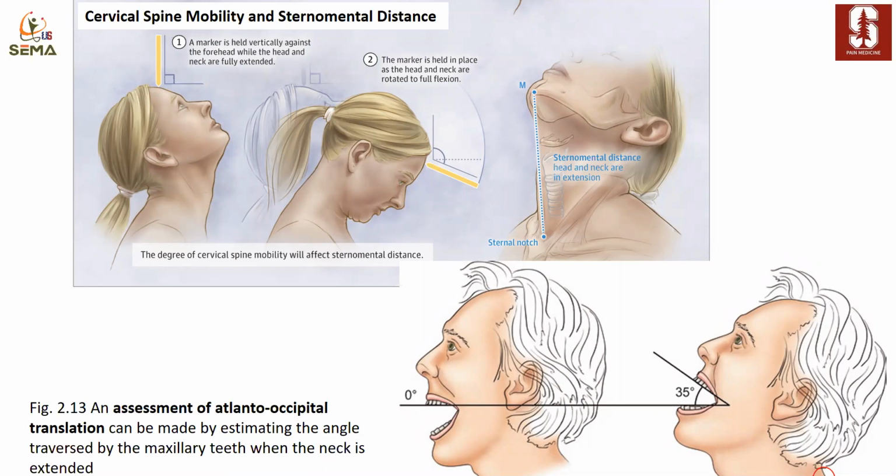So it's very important to know this before you go in and just do DL, and you want to know where the patient starts to experience some pain, because you don't want to go beyond that angle and cause problems for the patient.